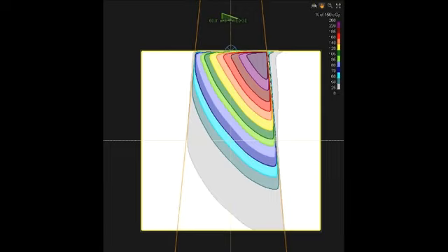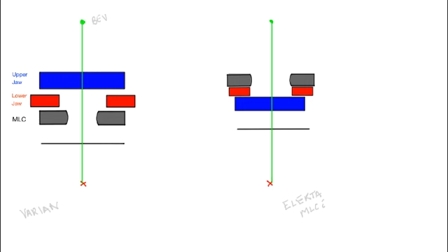So when I talked about Linacs before, I kind of glossed over the wedge aspect of things. They can be implemented in different ways by different vendors. So let me show you what that looks like. So one vendor puts the wedge down here at the bottom. That's a physical device, a piece of metal, different size pieces, 15, 30, 45, 60. The therapist comes in and out of the room and puts that piece of metal in.